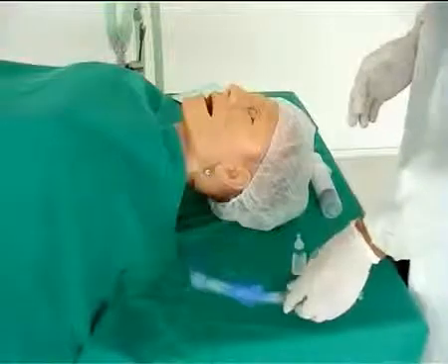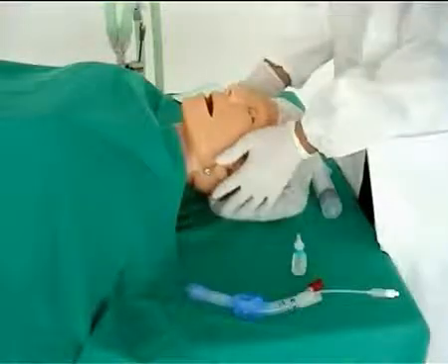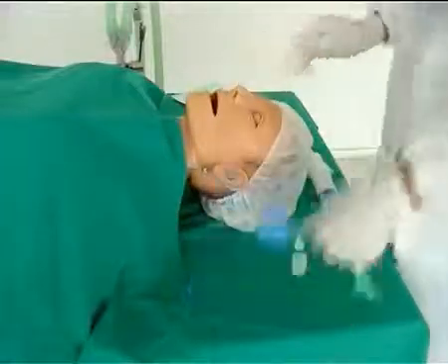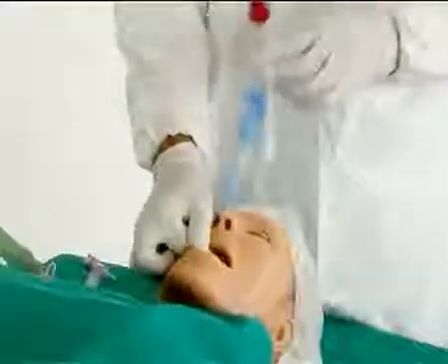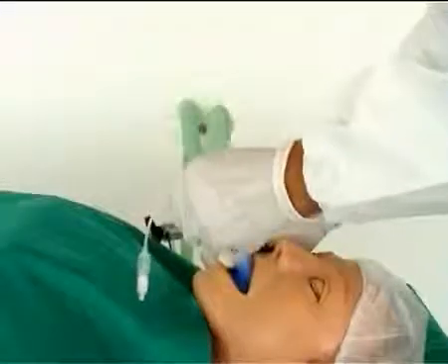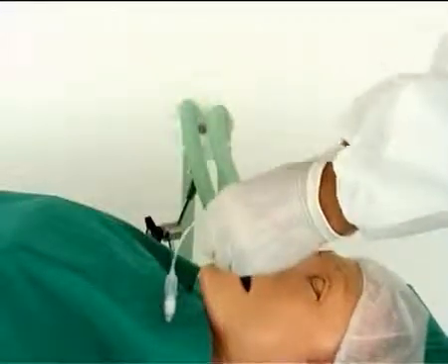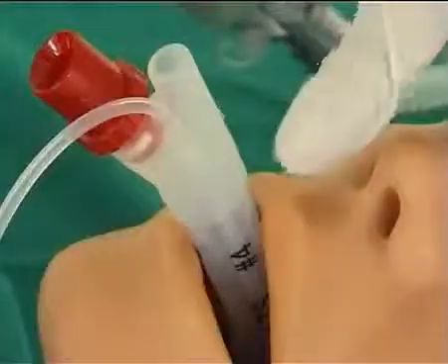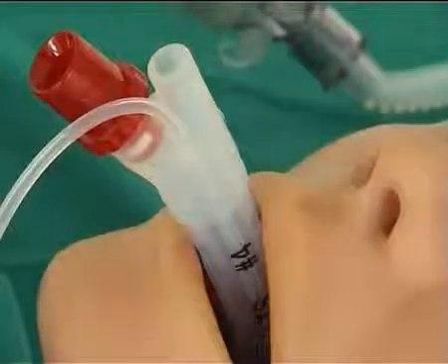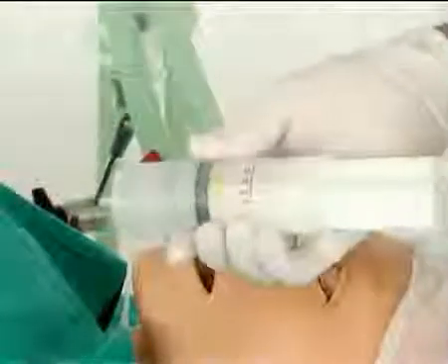For insertion, the head of the patient can be positioned slightly extended or neutral. Hold the LTS like a pen in the area of the teeth marks and insert it along the palate in the midline of the mouth until the teeth mark is level with the upper teeth. Inflate both cuffs with the volume indicated on the colour-coded syringe.